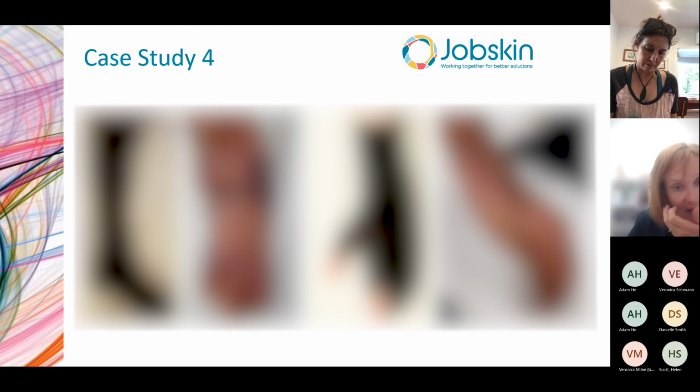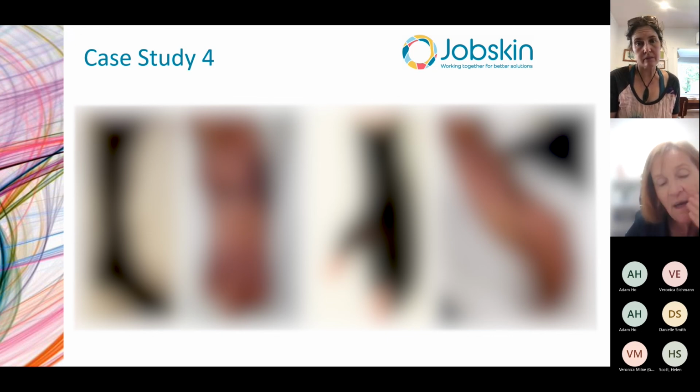And then the garment for his right hand, that flap, this injury was incurred in December of last year. That flap still joins the ring, middle, and little fingers together, but it will be subsequently divided, and so he'll be able to go into a glove at that point. But he's wearing almost like a cross between a glove and a mitten. But because he's very active and adept, subsequent garments we ordered with the leather reinforcement so that he could really do whatever he needs to do and is able to do with that hand. So that's been added just for durability.